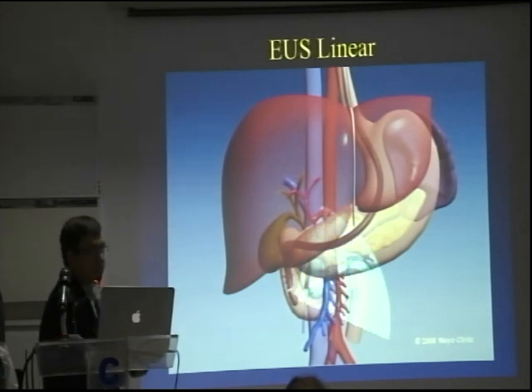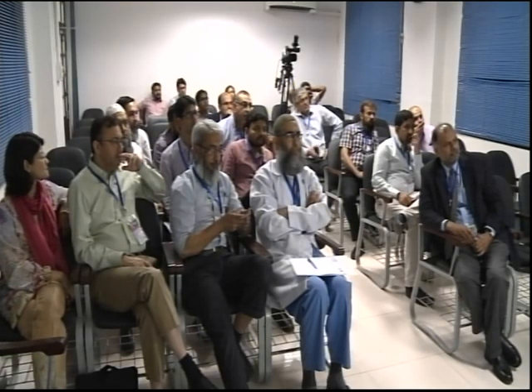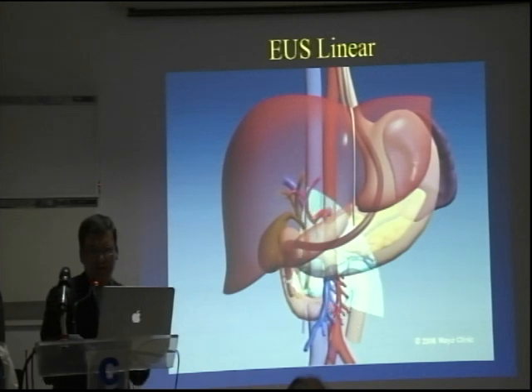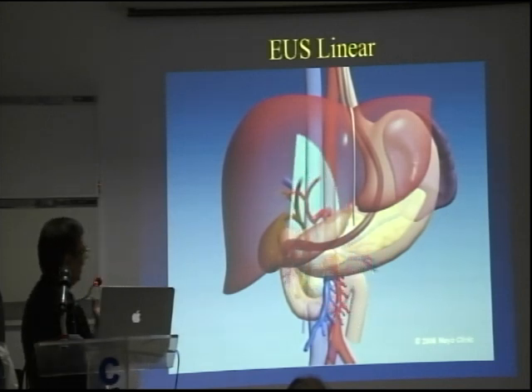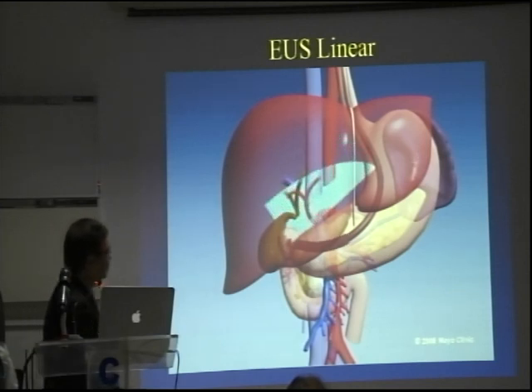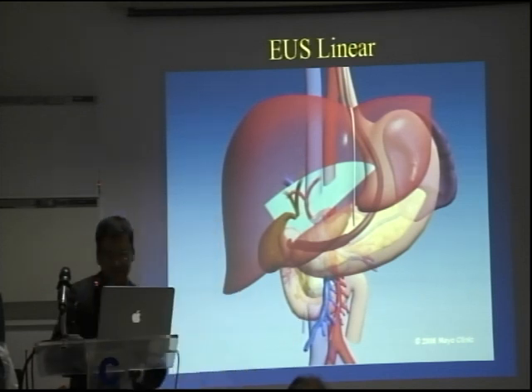Alan, do you follow the three stations in the duodenum? If you think about it, two and three just come along with the examination. Those stations, I think, were named by whoever developed them. What he's talking about is the second and third stations, first or second mostly. Let me show you.